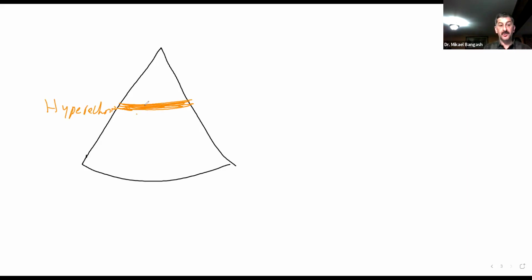It could have been a structure which was a bright reflector. Clear? But how would you be able to say that this hyperechoic strip across the screen, horizontally across the screen, is or is not a focal enhancement? Let me ask you, how would you be able to say this is mainly due to a focal enhancement?